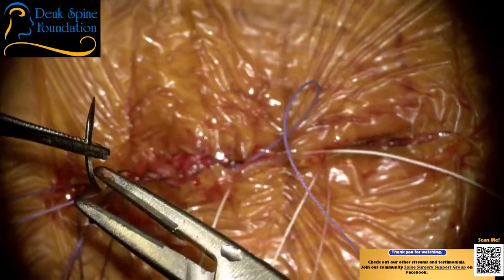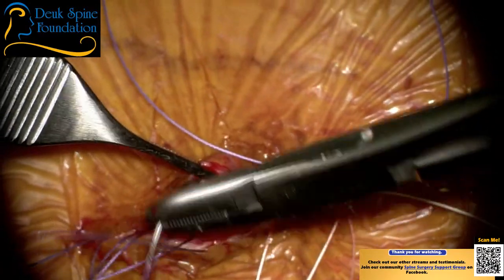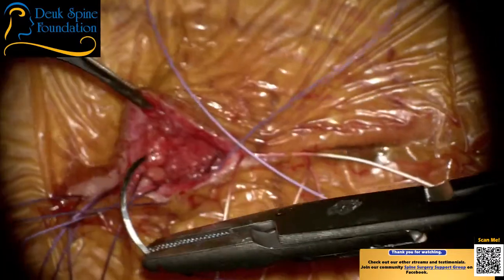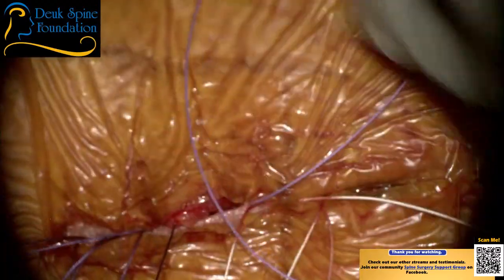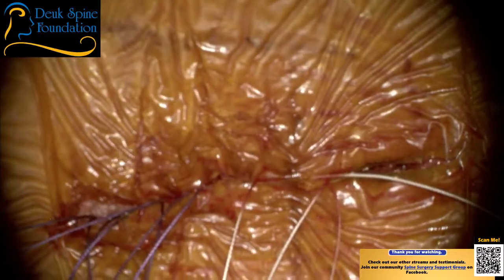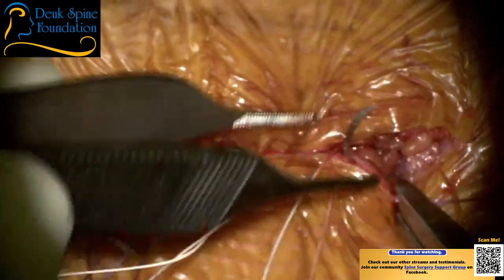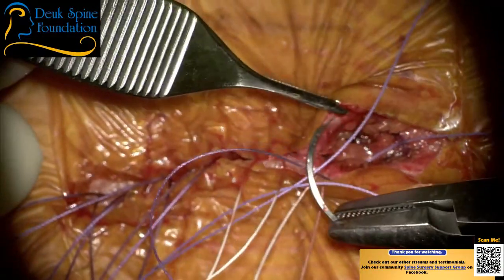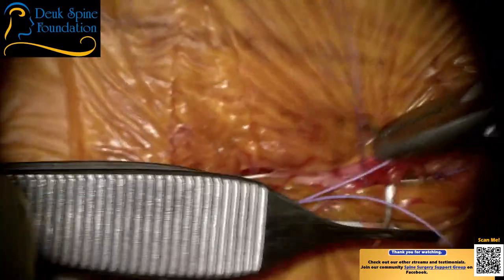See where I'm coming through, Dr. Patel? Now, a lot of surgeons don't close the skin with a microscope. I think I might be the only one that does that. But why not use the extra information you have, right? If you've got it, you might as well use it. It doesn't hurt your skin closure to have more visual information. It only helps.